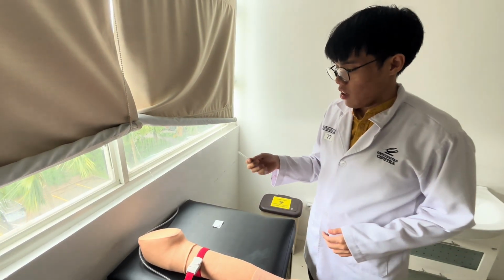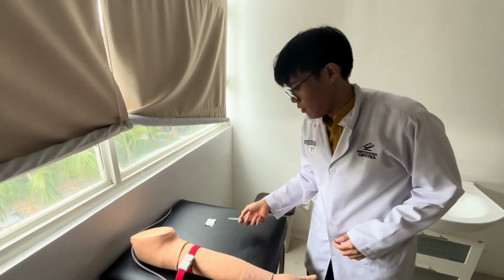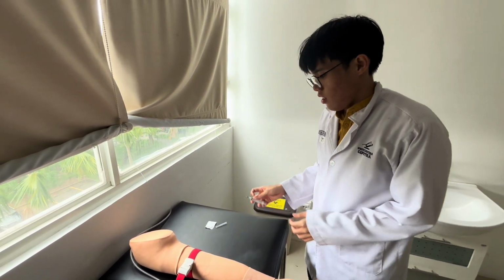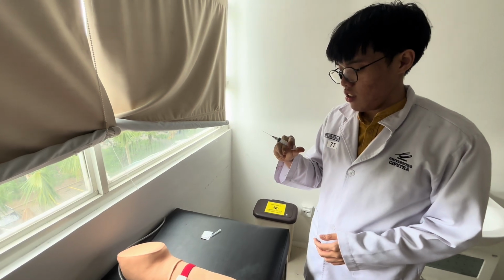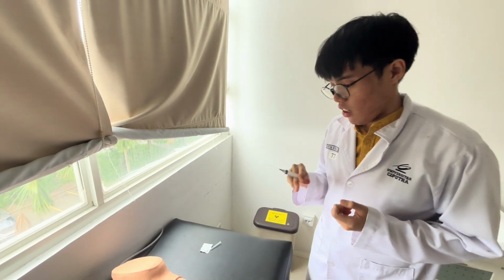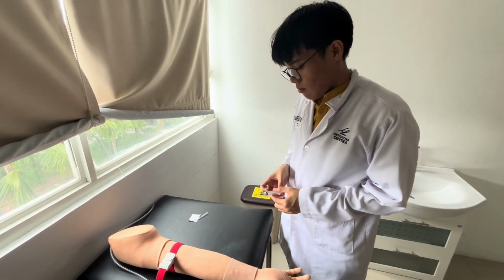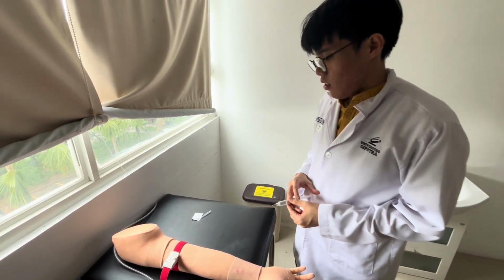So I will use one hand, and I will remove the top using my dominant hand. Then I will aspirate the syringe. Okay.